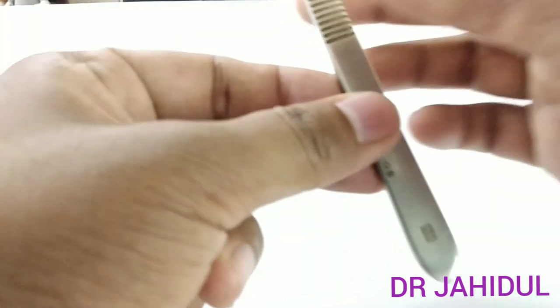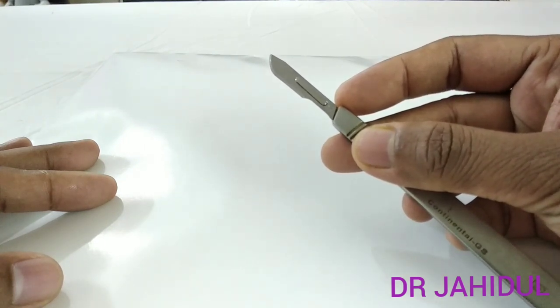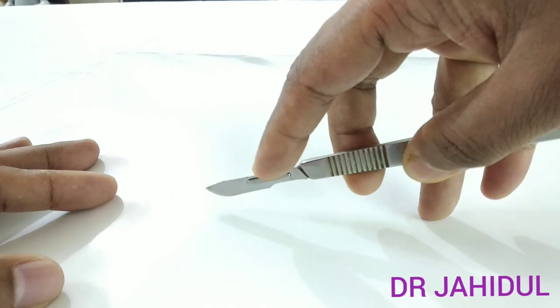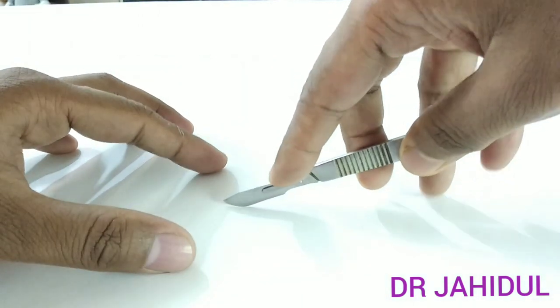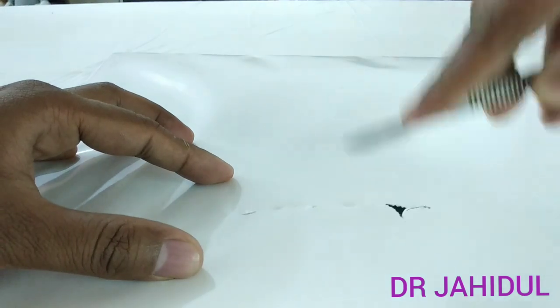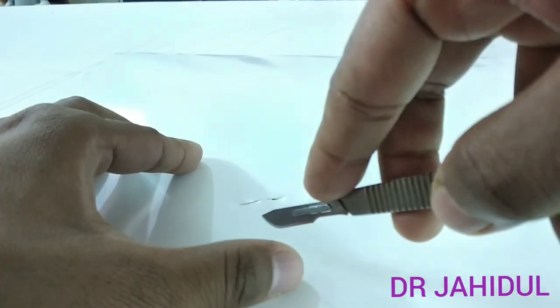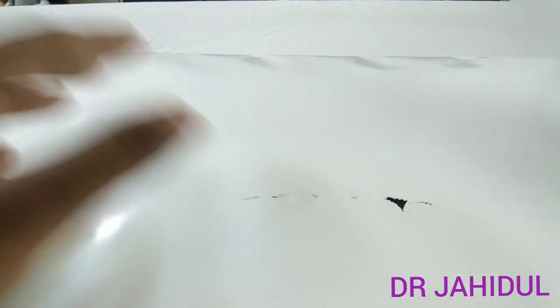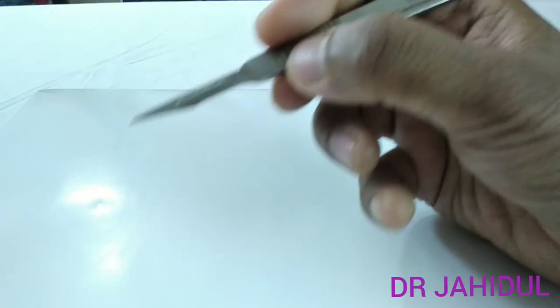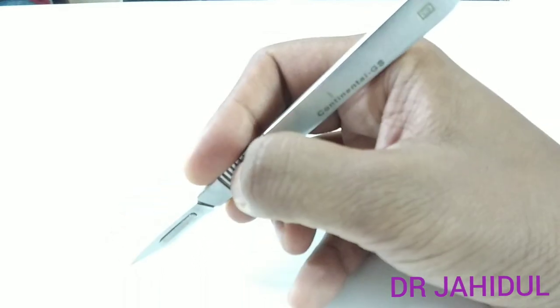When making an incision with a BP blade and handle, there may be two types of grip. When giving a large incision over the abdomen, hold the BP blade and handle like this and use the index finger to stabilize the blade. You must not take the incision in a way that could injure your thumb or index finger. When doing fine work with a fine scalpel handle, hold it in a pen-holding manner and stabilize it with the little finger.